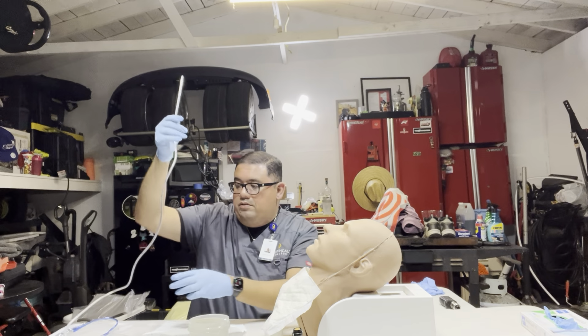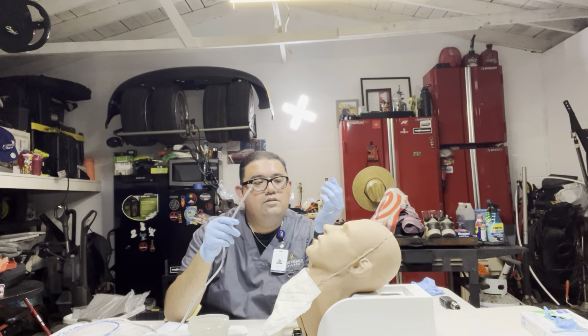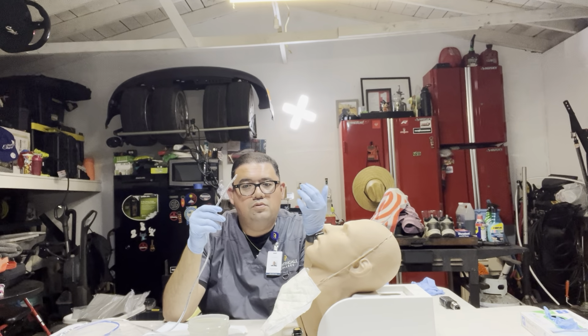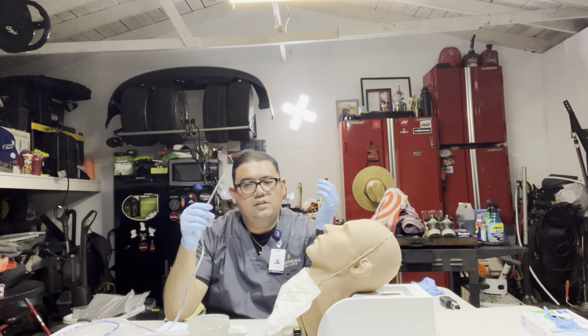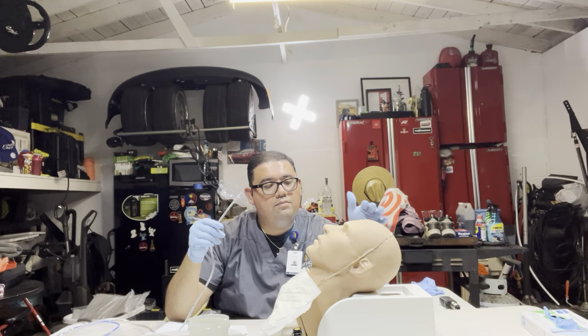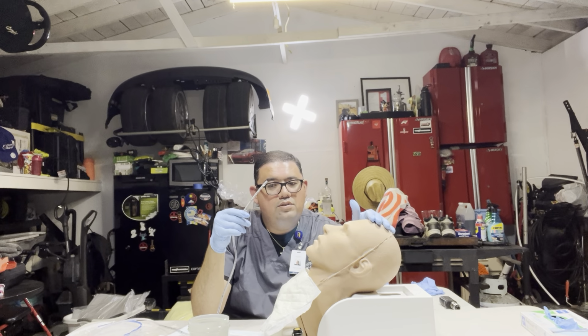And then with the natural curve of the tube, I'm gonna go ahead and insert the tube into the patient's right nostril. I'm gonna ask the patient to hyperextend his neck. Mr. James, I'm gonna have you hyperextend your neck. And then I'm gonna start to insert the tube into your nostril, okay?